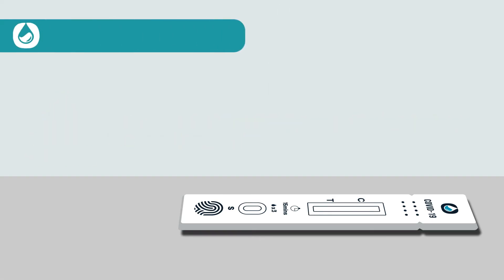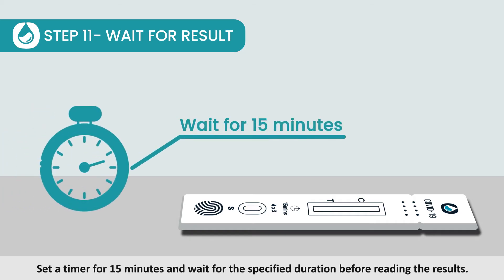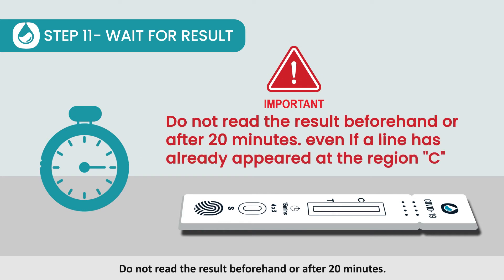Step 11: Wait for result. Set a timer for 15 minutes and wait for the specified duration before reading the results. Do not read the result beforehand or after 20 minutes, even if a line has already appeared at the region C.